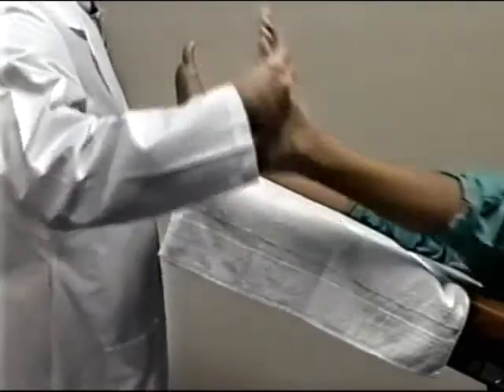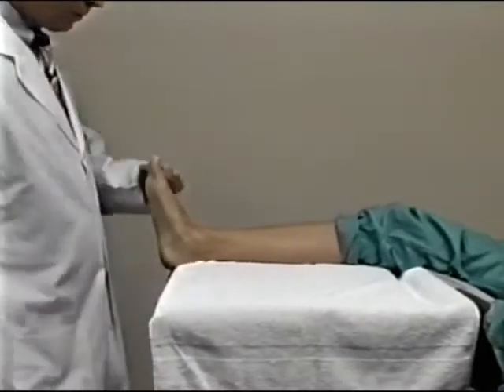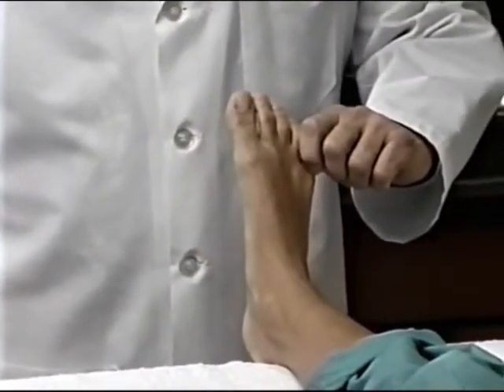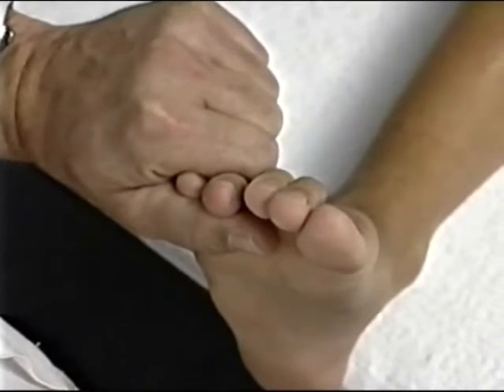First, make certain the patient is in the correct position and comfortable so as to facilitate an accurate cast. Bend the knee slightly on the sagittal plane and place the foot so the toes are pointing straight up. Position the foot by holding only the fourth and fifth toes using your thumb in the middle of your index finger.